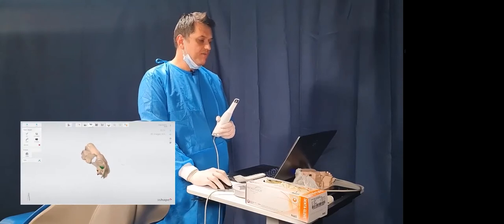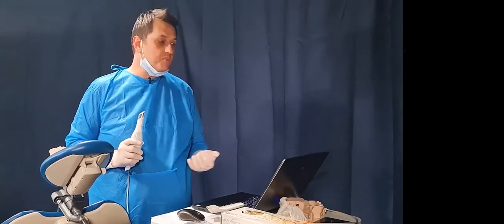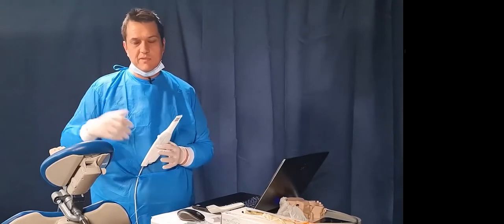So let's now have a look in the mouth again at how the hand position helps to attack those undercuts. Now this is a very basic partial, right? In this instance, I'd probably prefer an implant for this patient if the bone was sufficient, but let's say we're just doing a small little denture, if it's a chrome, or a little Valplast potentially, or whatever it might be. We do need to get those undercuts so that the lab knows exactly what they're working with.